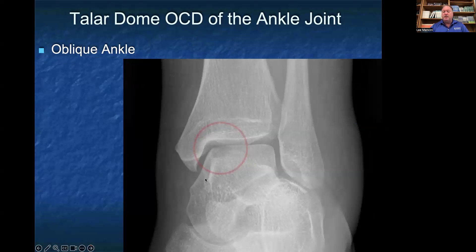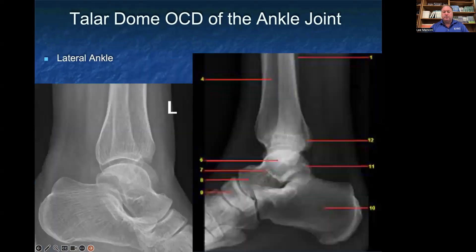This is right along that medial aspect of the talus, just lateral to that medial malleolus coming off the tibia. On a lateral ankle view, it can be a little bit harder to see, but you're trying to evaluate the contour of the talar dome on that lateral ankle view. You can clearly see the navicular bone in front of the talus, the calcaneus below the talus, and then your tibia and your fibula.